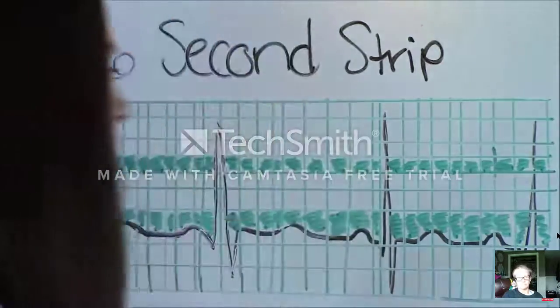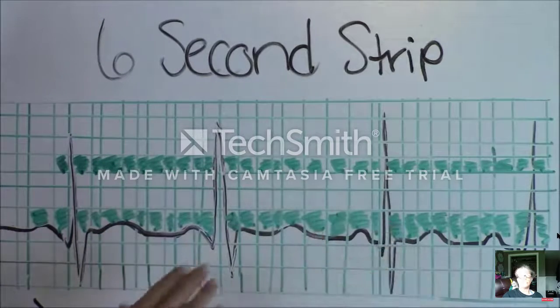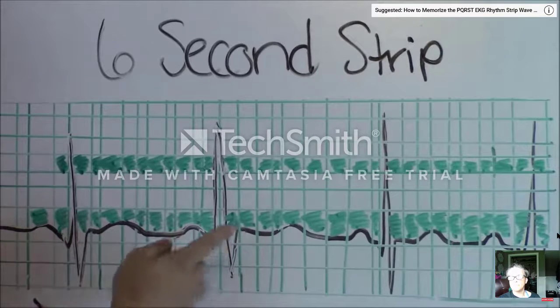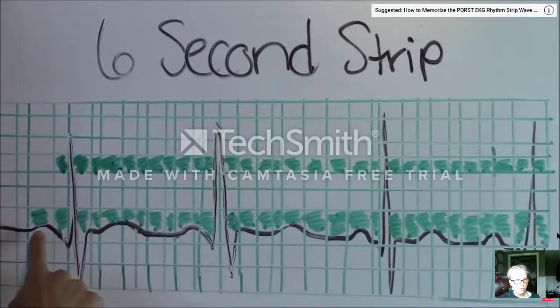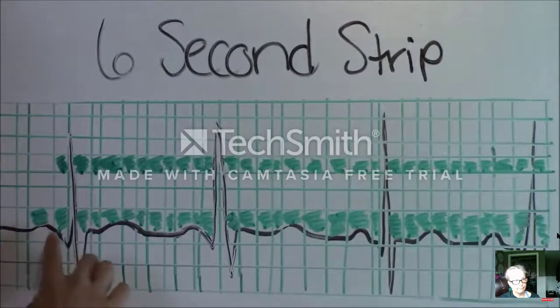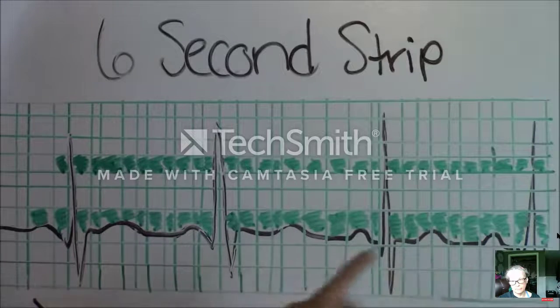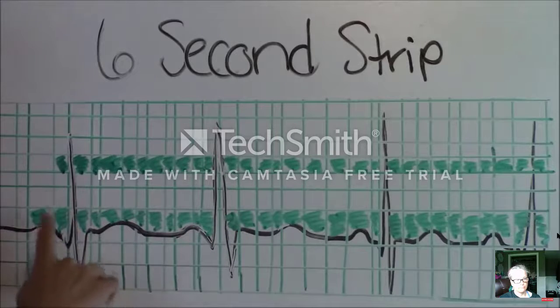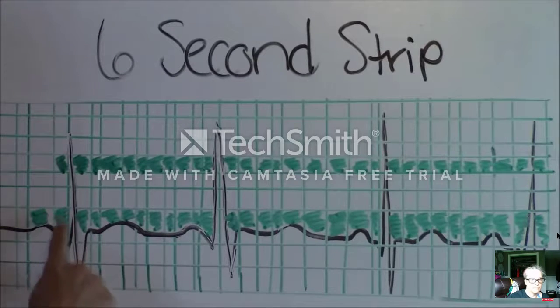Okay, behind me, we have this rhythm. You're going to count either your atrial or your ventricular rate. First, we'll start with our atrial rate. Remember, atrial rate is represented with your P waves because it represents atrial contraction. We have a P wave here, here, here, and here. To use the 6-second rule, we start right where the P wave is, measure the large squares, count till we get to 30 and stop, and see how many P waves are in between those 30 squares.